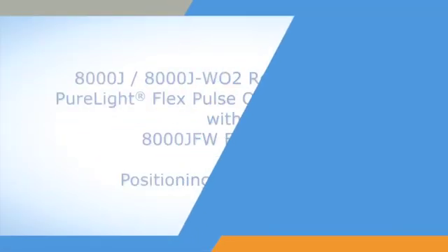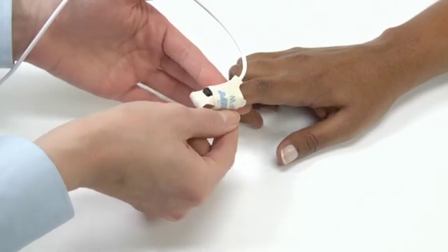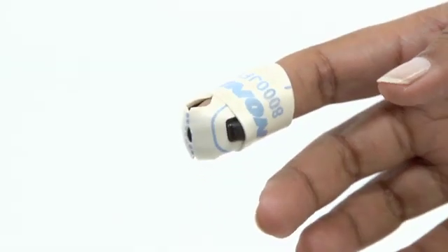This short video shows how to properly position and secure the Nonin 8000J or 8000JWO2 Pure Light Reusable Flex Sensor using disposable 8000JFW FlexiWraps.